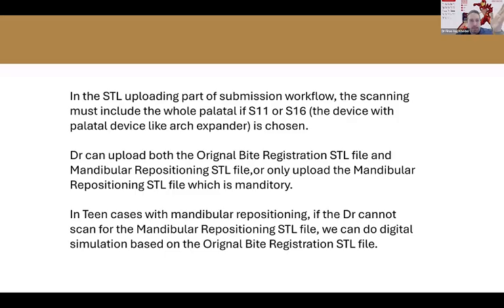In teen cases with mandibular repositioning, if the patient is growing and you cannot take a proper wax bite, you can simulate it digitally in Smartee.